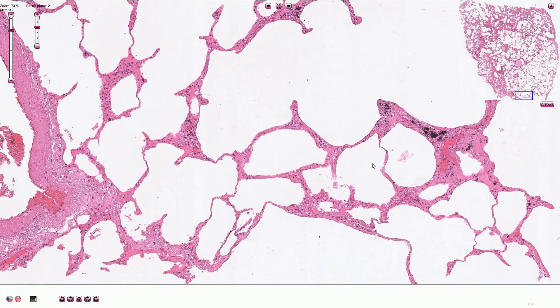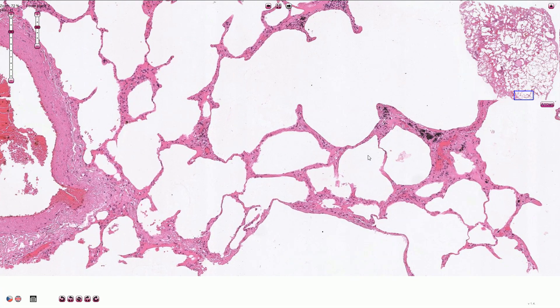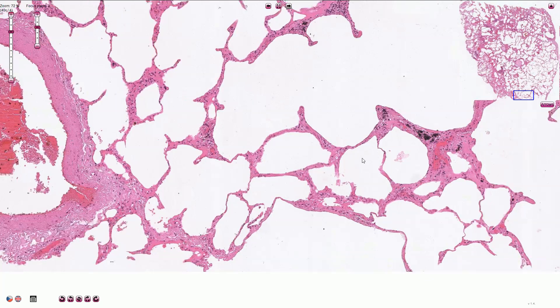We can recognize a few subtypes of emphysema. Centriacinar emphysema is typically associated with smoking and is more prominent in the upper lobes. Panacinar emphysema is more prominent in the lower lobes and can be associated with alpha-1 antitrypsin deficiency.